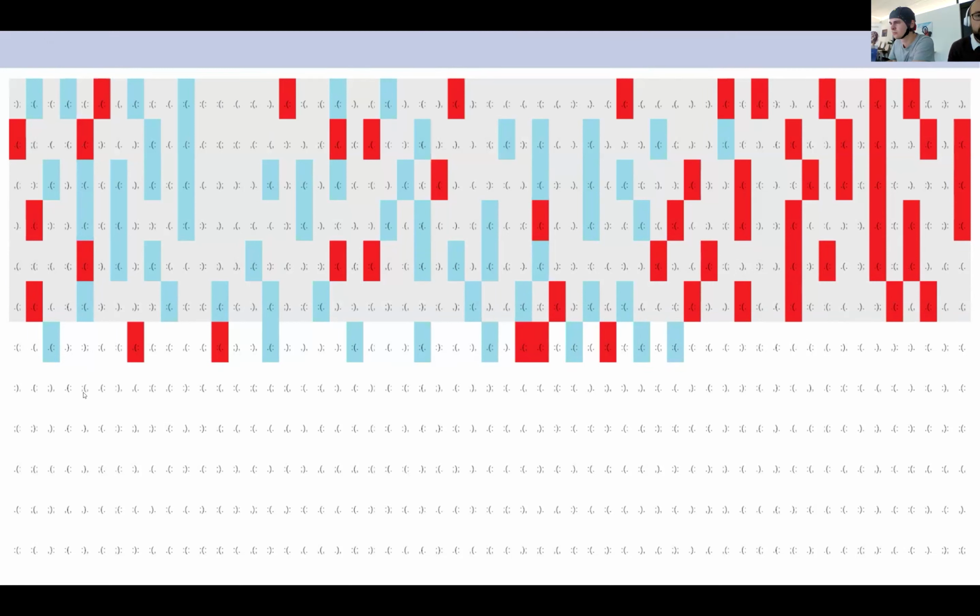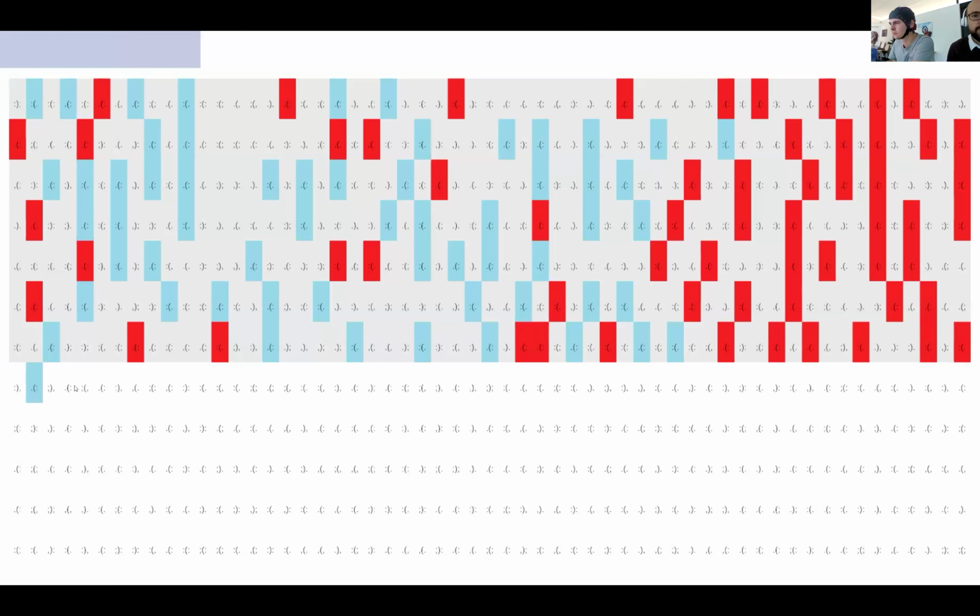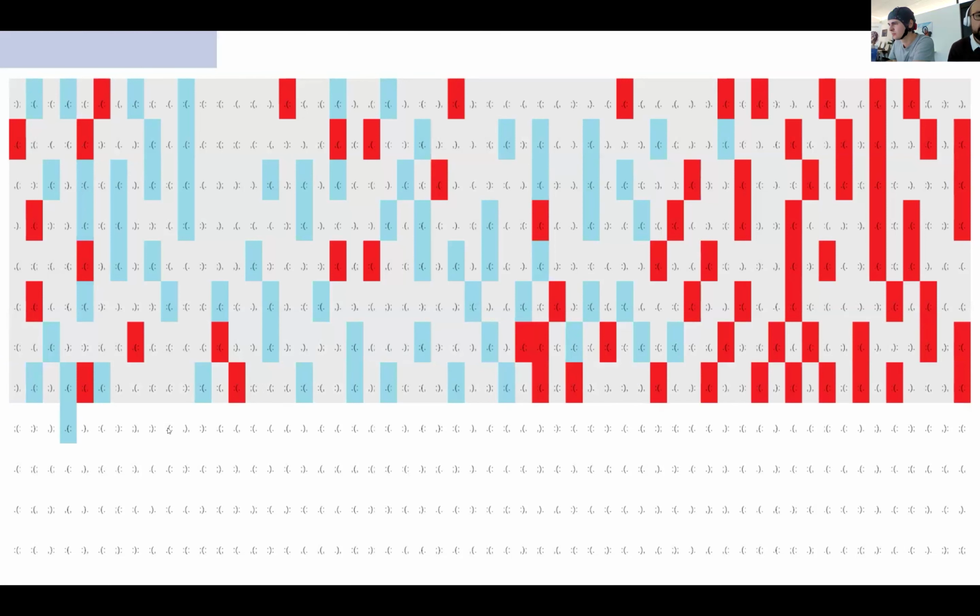There are always applications which you will want to make sure that there are no jitter nor anything. So a trigger cable is always a very good solution. But if you are not caring too much about the precision of the start and the end of a task, these kinds of applications are pretty neat. So you can use this for EEG, for fNIRS, for whatever you want to use.